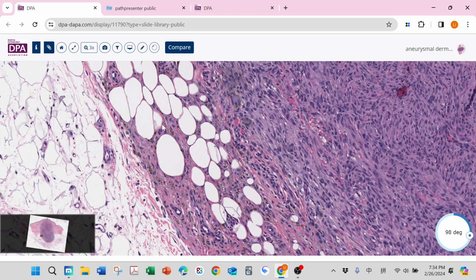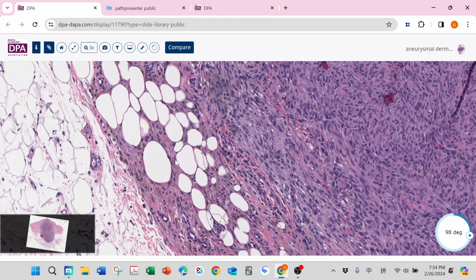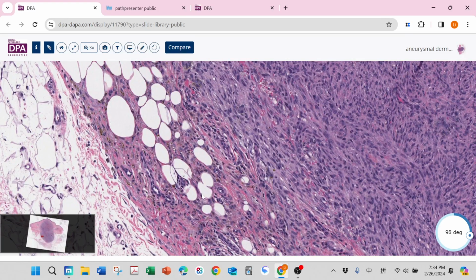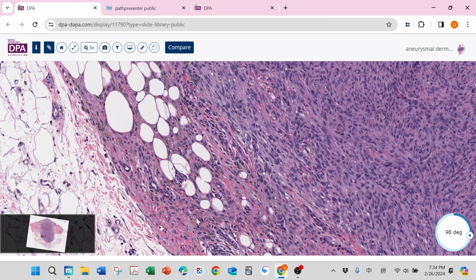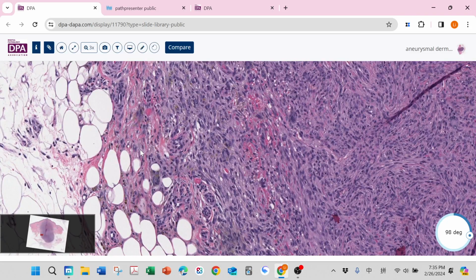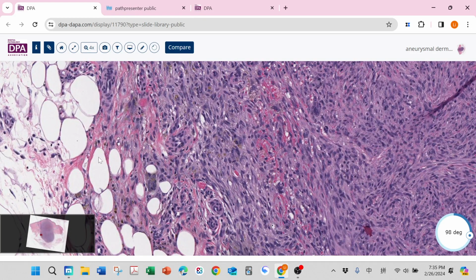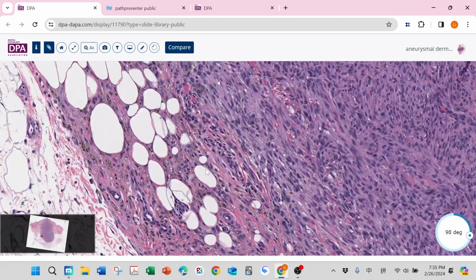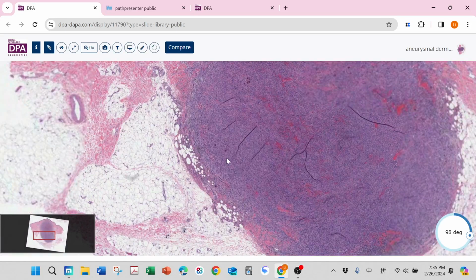So dermatofibroma may cause some of the fat to look almost like necrotic fat. You can see this different shade and size of the fat. They also have this inflammatory reaction. You can see lymphocytes and other inflammatory cells around the collagen and this fat trapping. Not like DFSP, where the fat is kind of happy to be surrounded by the DFSP, so you won't see this kind of big adipocyte, small size, and then inflammatory infiltration around the fat.